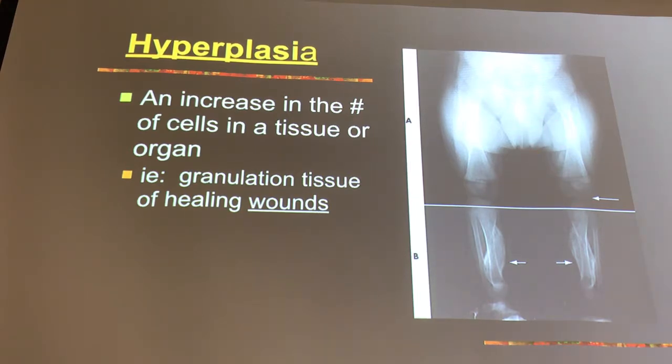What scale of contrast should that be? Come on now. Going into next year, it's going to be a little different because people aren't going to have me for clinical coordinator, but some of you in here should know this already. What's it supposed to be? Short scale, whoever said that. What is it? It's long, right? Now, who in here does not understand that? Everyone understands you're looking at basically a long-scaled, short-scaled image. Is that true? Yes? Okay.